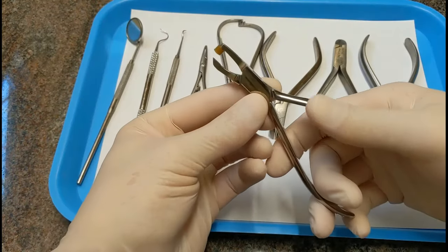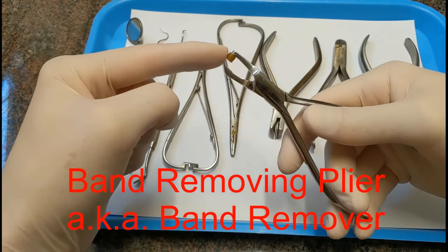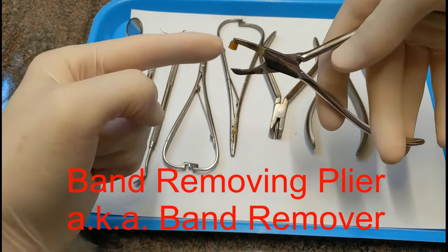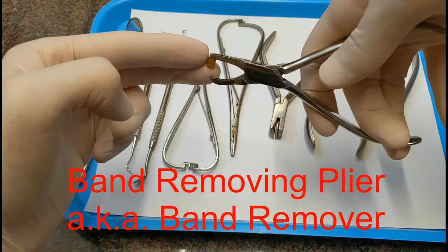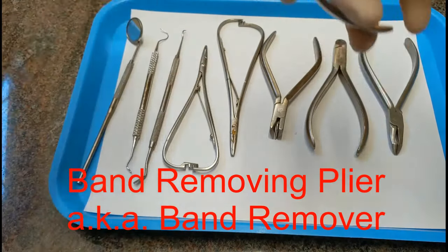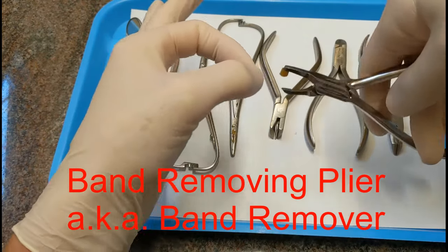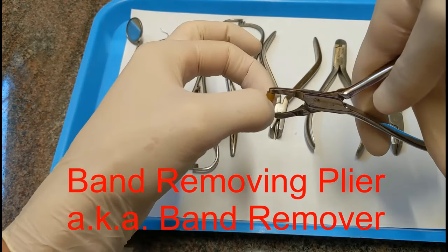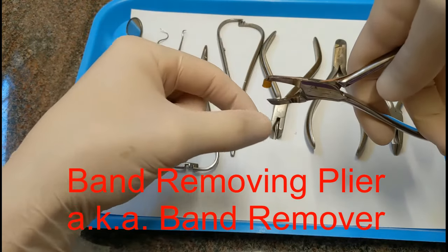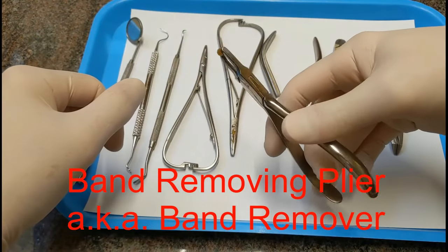This is called a band removing plier. It has a plastic end that sits on top of the tooth, and then this jawed end goes under the edge of the band. As you pull, it will slide the band off the tooth. The plastic end goes on top of the tooth and the band is positioned so that edge catches the bottom edge and lifts it off the tooth.